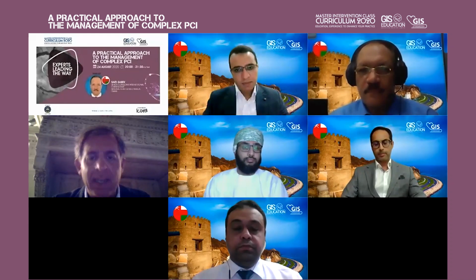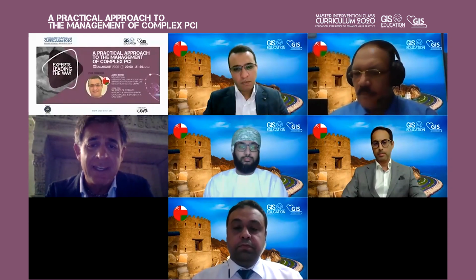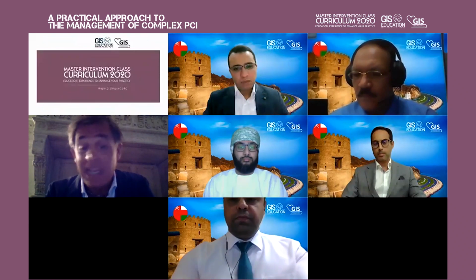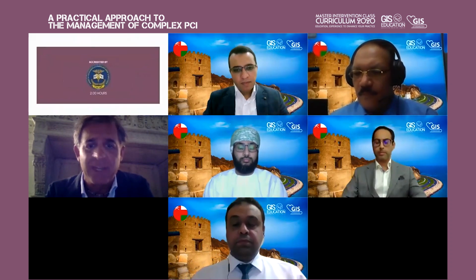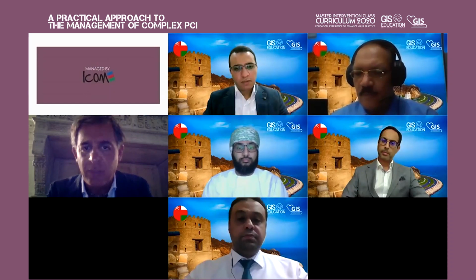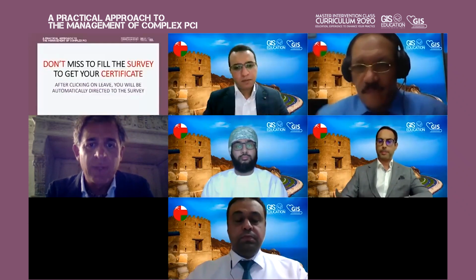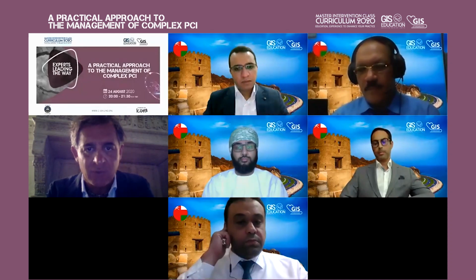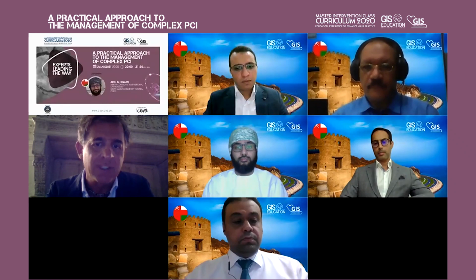Really, I didn't have any experience with it. I don't think that technique can make the difference to increase the success, but I didn't try. You risk having a sort of geographic miss at the level of the ostium of the side branch, and this is what we want to avoid by performing a mini crush. Do you agree? With what you explained very well, you need to enter through the proximal strut in order to avoid missing the ostium. If you go through the distal strut, you risk a miss also. And in this nano, I think you increase the risk of missing the ostium of the diagonal without struts.